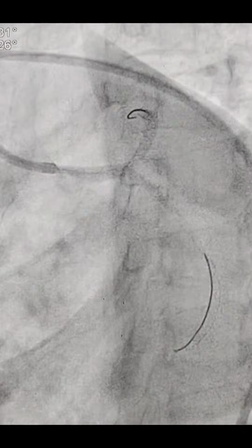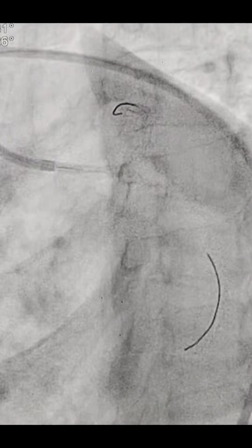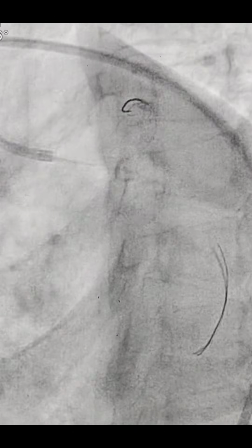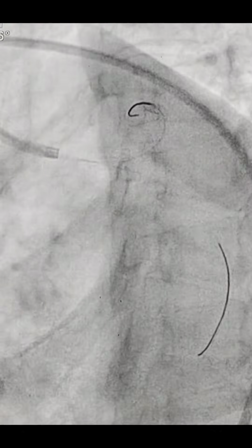So this is the scene after the stent deployment in the left main to LAD. And I didn't have any pinching of the LCX now. So we were lucky not to have a pinching of LCX. LCX is flowing TIMI 3. And so this was the scene after the placement of the LM to LAD.